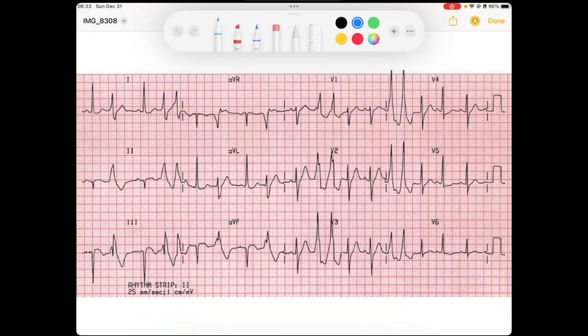This is an interesting EKG — as you can tell, it looks all over the place. Starting at the bottom, we don't get a full rhythm strip, but I'm going to count off: I see narrow QRS, funky QRS, narrow QRS, funky, funky, narrow, funky, narrow, funky, narrow, funky, funky — a mix of narrow and funky beats throughout.